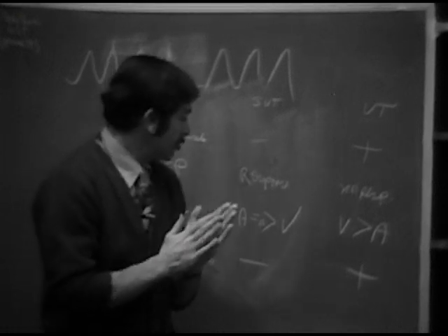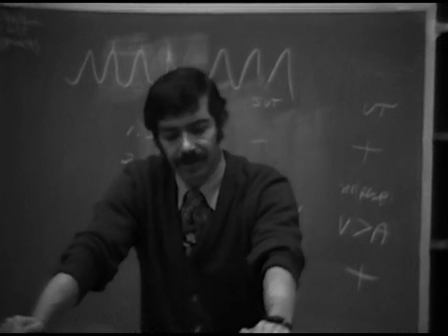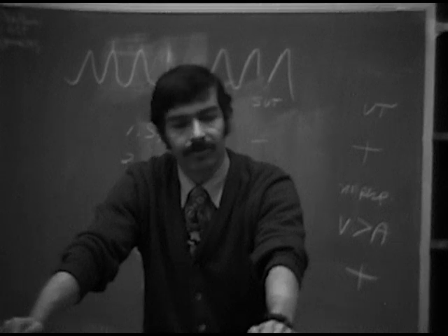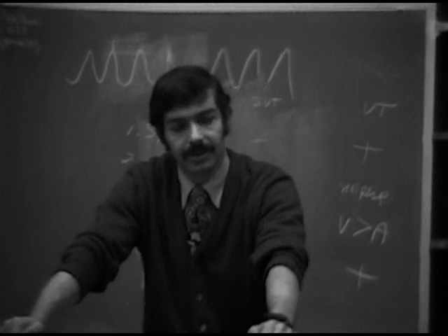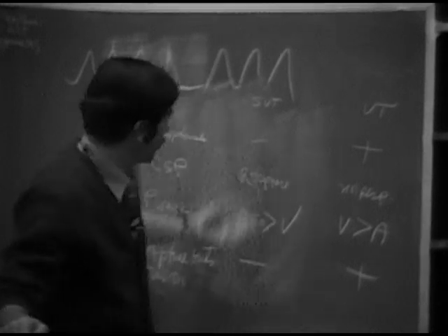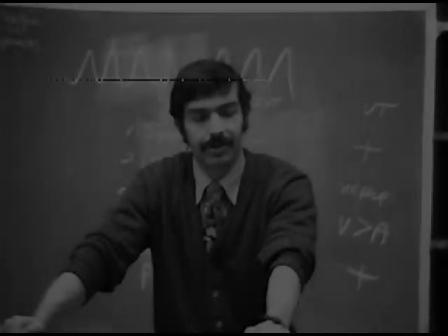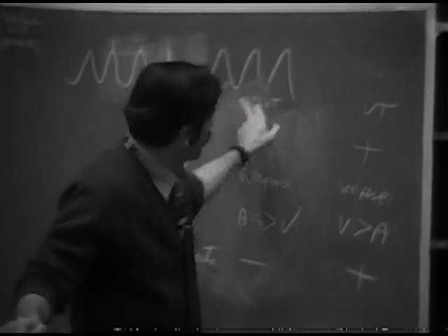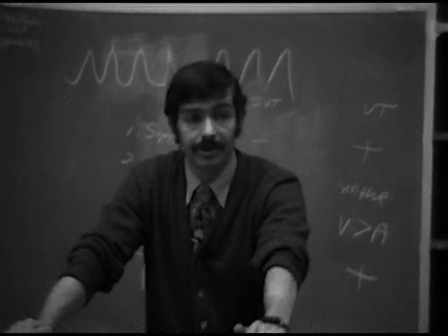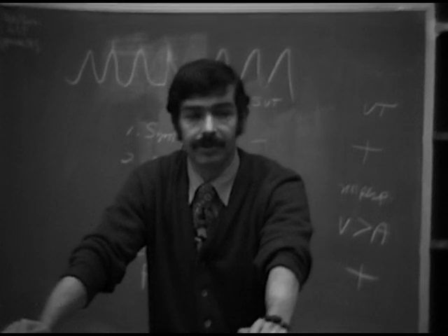So these are 4 guidelines that can help you. And as I said in the beginning, if the patient's doing very poorly, this is sort of an academic exercise. And actually, you're doing the patient a disservice to go through a routine to try to differentiate. You might just as well put the paddles on and shock them right away. Certainly, if it is ventricular tachycardia, you want to move very quickly and cardiovert him, because the rhythm may degenerate into ventricular fibrillation.